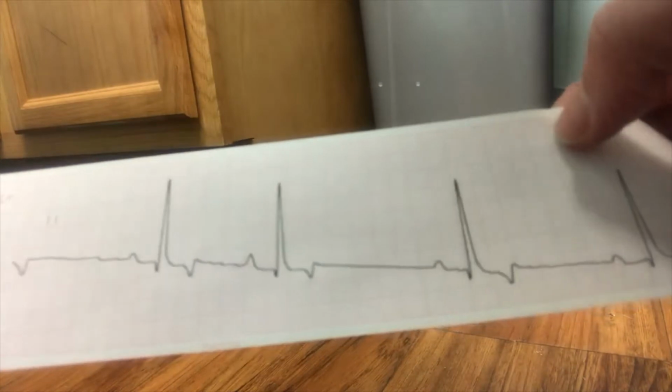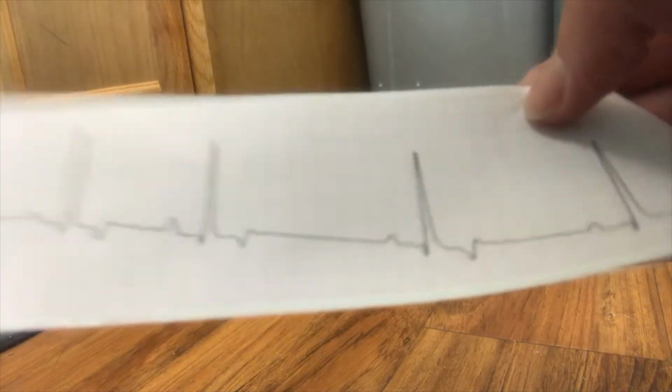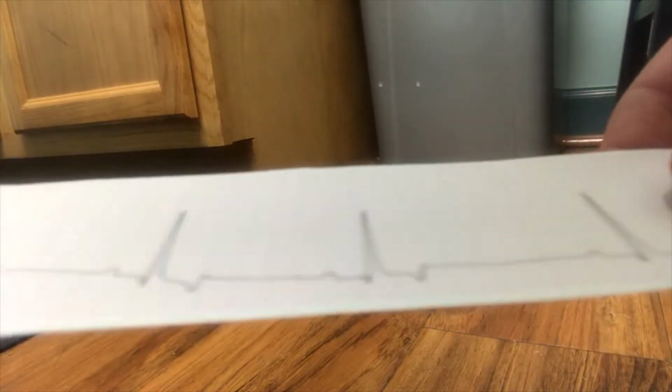So now that we have our strip here, kind of come over here so we can rest a little bit. Main things that you want to look for is patterns. Are there any irregularities? And if they are, are they regular irregularities or irregular irregularities? Here they're all looking pretty regular.